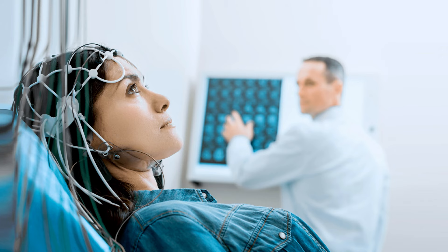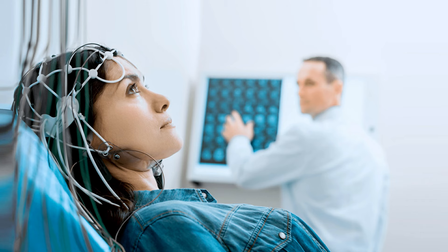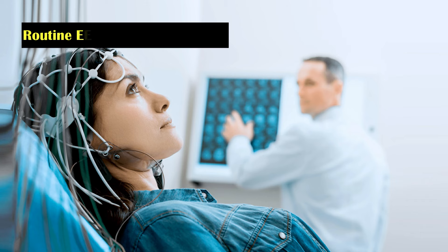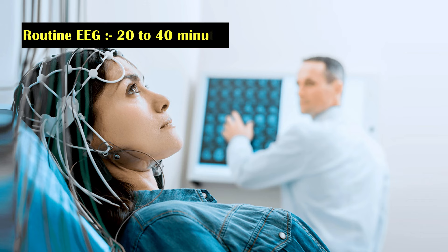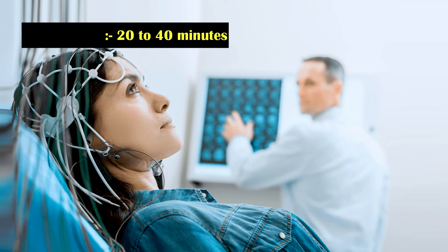About 20 electrodes, which are connected to a recording machine, are attached to the scalp. A routine EEG recording usually takes around 20 to 40 minutes.